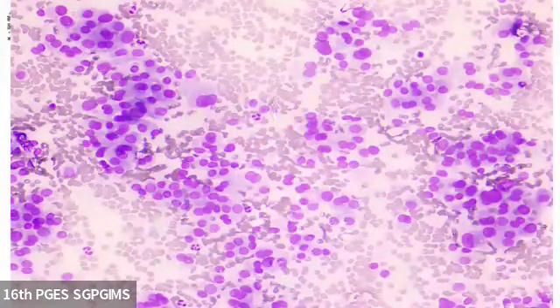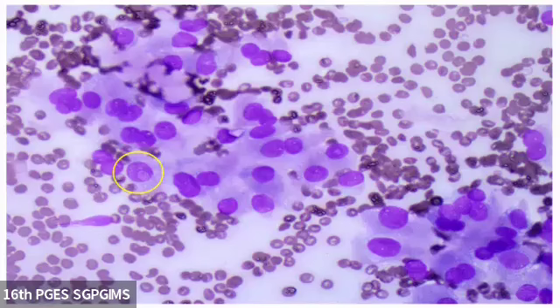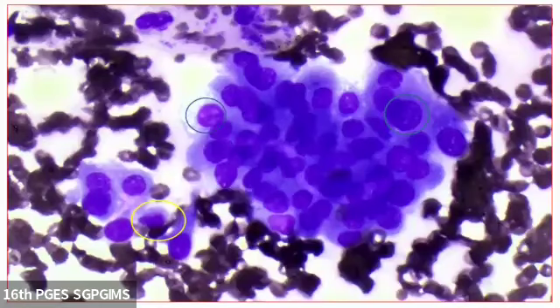This is the higher power view of the smear, displaying the tumor cells which are disposed in clusters, and the tumor cells are overlapping with each other. Further higher power view shows the tumor cells having enlarged nuclei, conspicuous nucleoli at the periphery, and a moderate to abundant amount of eosinophilic cytoplasm. Few nuclear pseudo-inclusions are also noted in the tumor cells. This is a further higher power view, displaying the nuclear pseudo-inclusions and nuclear grooving among the tumor cells.